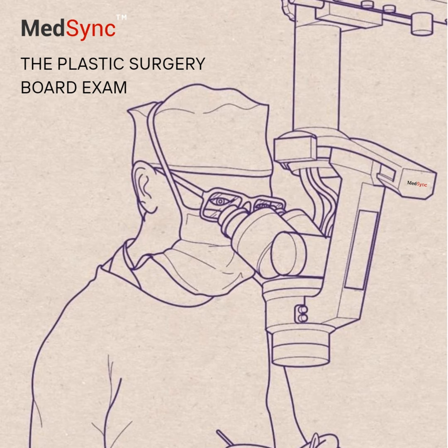Hair removal, another big application. Target is melanin again? Yes, melanin in the hair follicle and shaft. Common lasers are diode around 800 nm, Alexandrite 755 nm, and Nd:YAG 1064 nm.